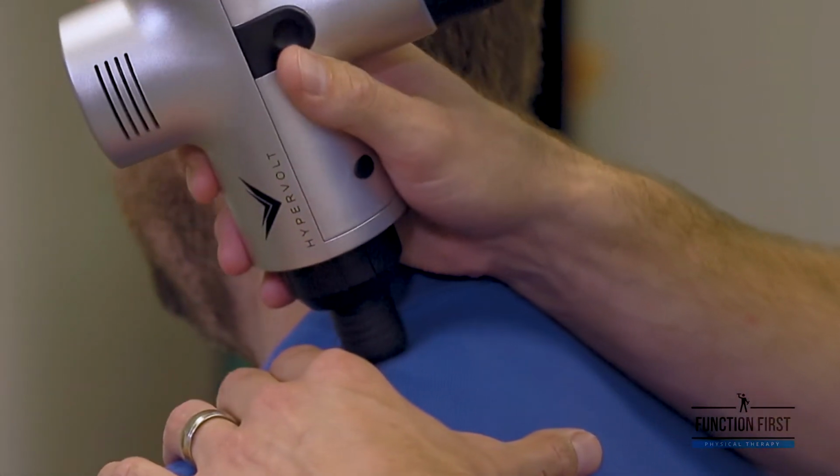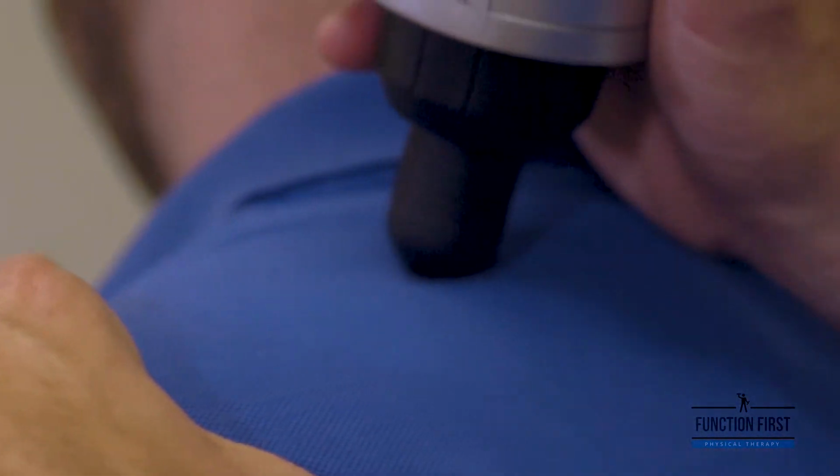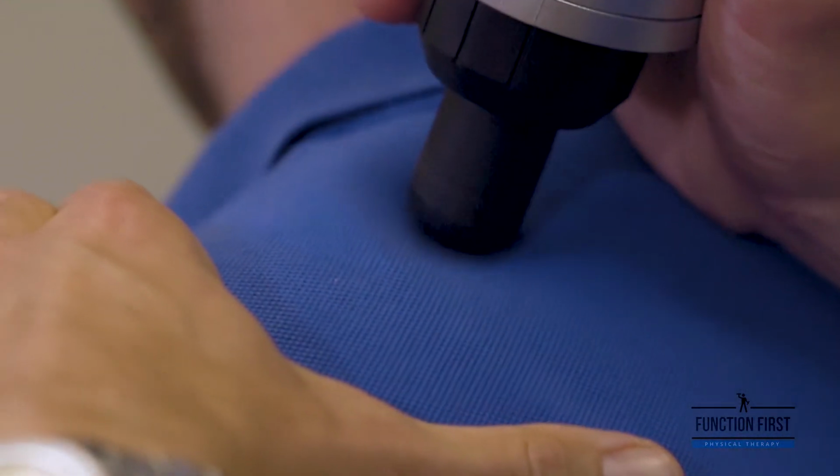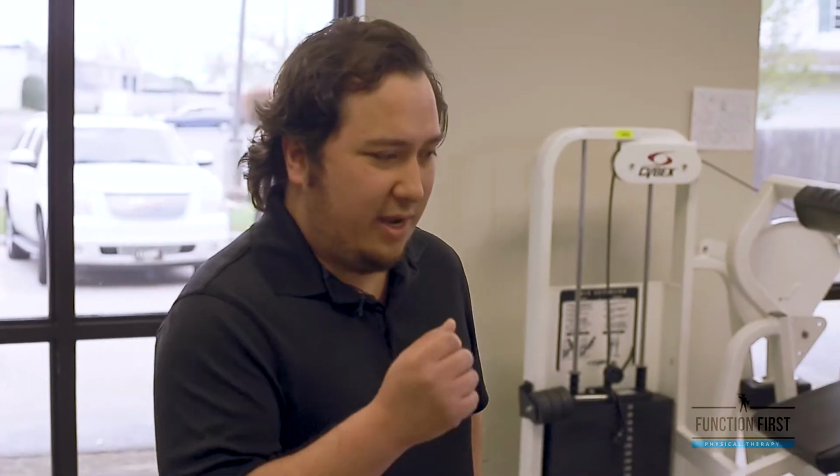The varying tips allows us to work on different areas of tissue. So Matt is using the finer, more for trigger point head, and we find that really gets those knots out really well, like he's demonstrating with Greg right now. He also has other heads for other parts of the body, whether they be bony or just kind of tight, or really meaty parts like say the glute or the hamstring.